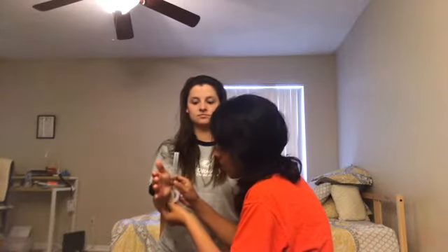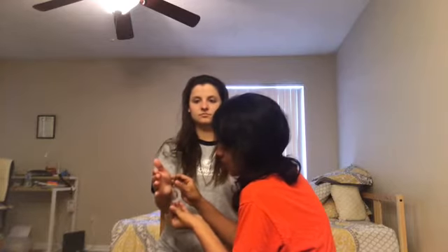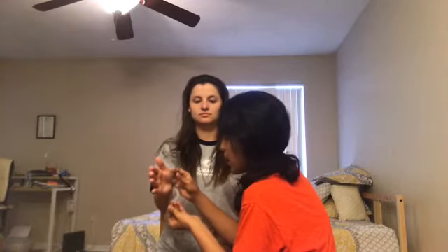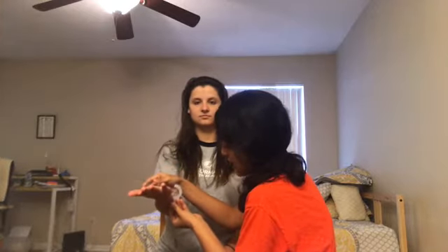We're going to perform range of motion for forearm supination, and we're going to place the axis on the ulnar styloid, and the stationary arm would be parallel to the anterior midline of the humerus, and the distal arm would be on the ventral aspect of the forearm. And can you perform forearm supination? And it is 80 degrees.